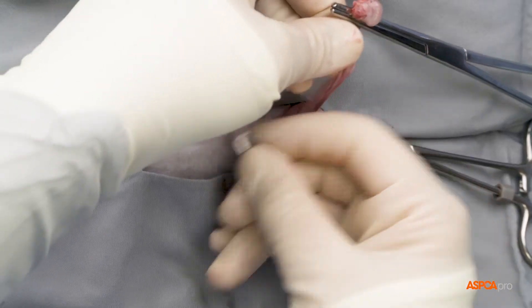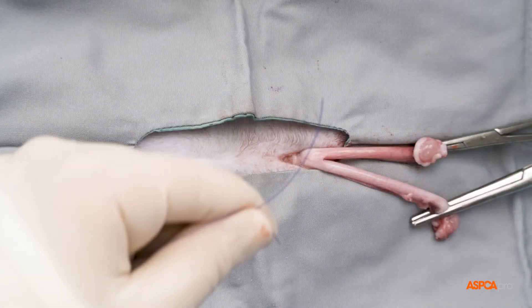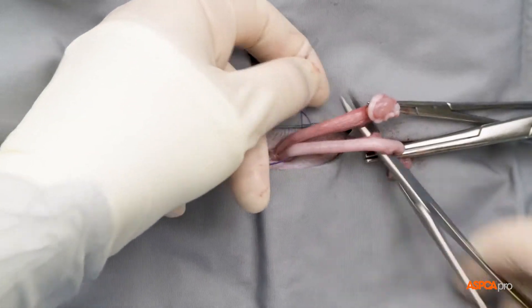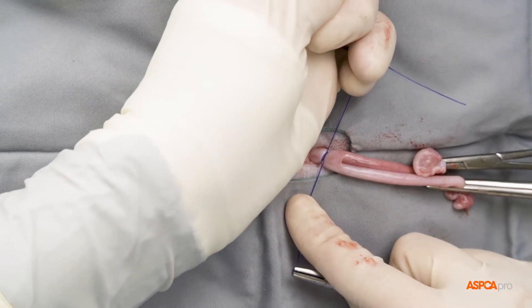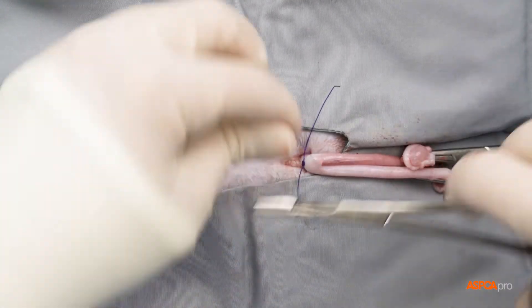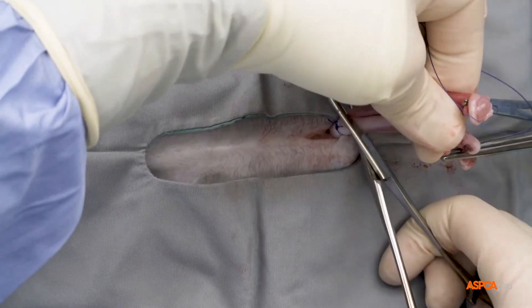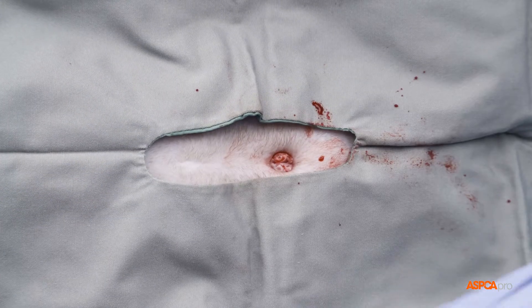Once the surgeon has completed the second side and cleared any tissue from the uterus, a strangle knot is used to tie off the uterine body. Additional knots may be placed in more complicated surgeries, such as pyometras or pregnant spays. The knot is tightened and additional throws are used to secure it. The uterine body is now cut away, and a small tissue tag is left behind and put back inside the cat's body once the surgeon confirms hemostasis.